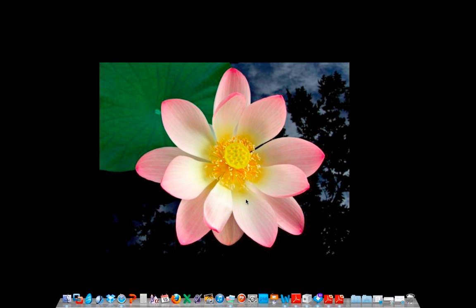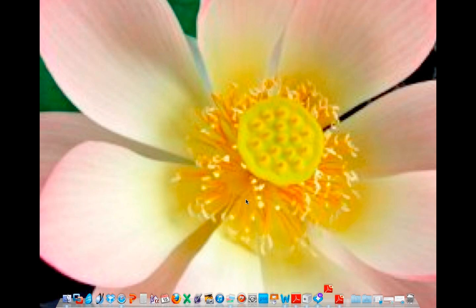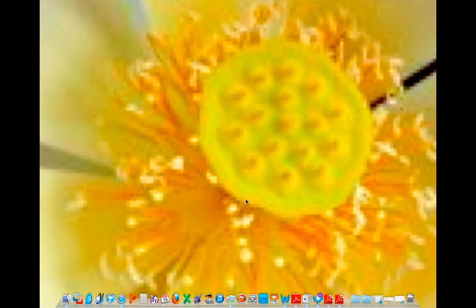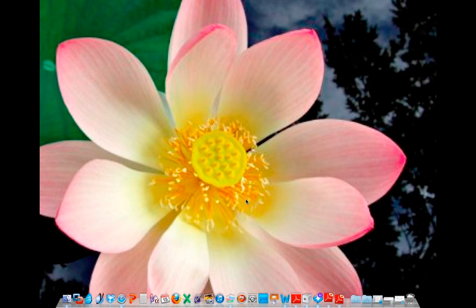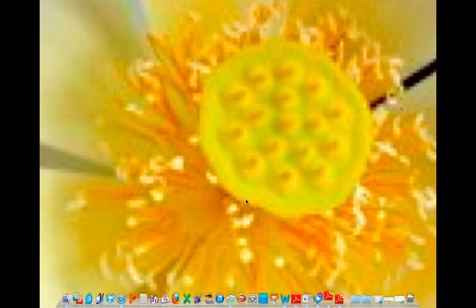In front of you, if we're not on any form of audio delay right now, you should see a picture of a flower. Now, as I zoom in on the flower, it still looks like a flower. And as I zoom in, it starts to get a little fuzzy, or as we call it, pixelized. If I zoom in a little bit further, now you can see lots of little squares of color, right? Those little squares are pixels. People think of them as dots, but they're actually squares, and each one can only be one color. But if you go backwards and look, it makes up a picture. So again, as you come in, the image gets more pixelized.